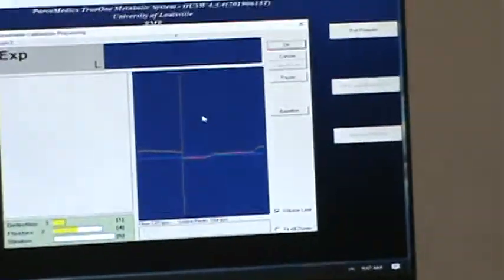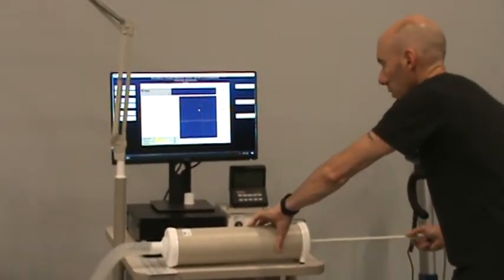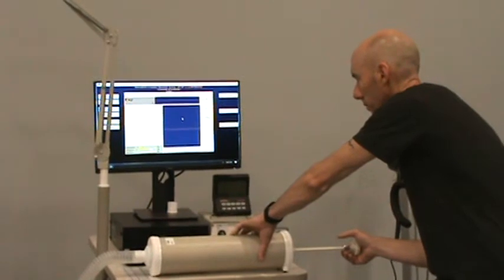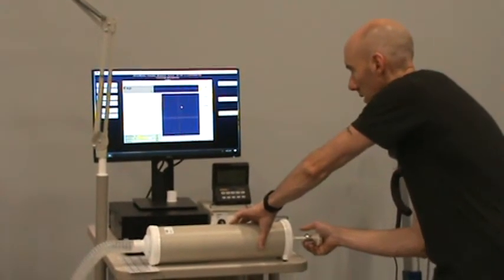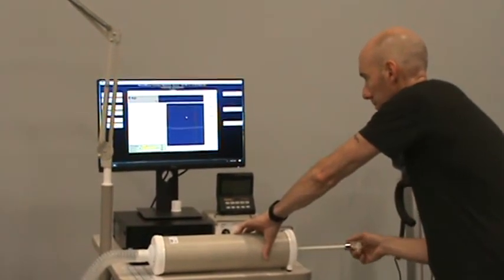It's almost agonizingly slow. So this is my last flush. I'm going to go very slow just to practice the force that I need for the actual test itself. I'm not quite under the blue line, but I'm right touching it. All right, so these next 5 are going to count.